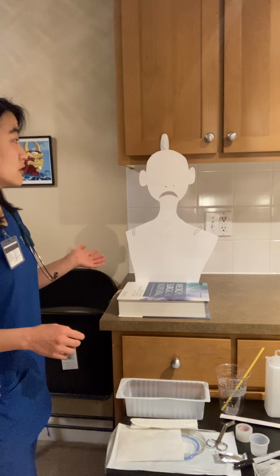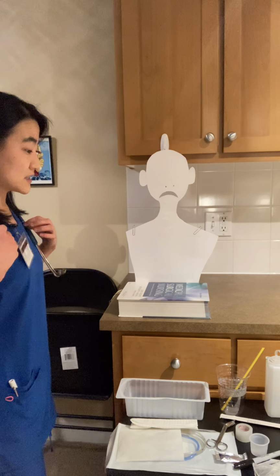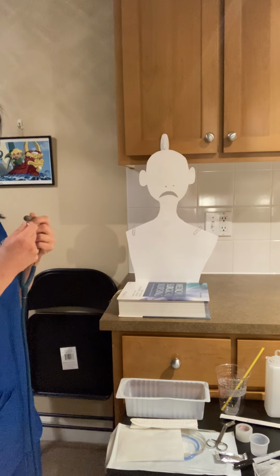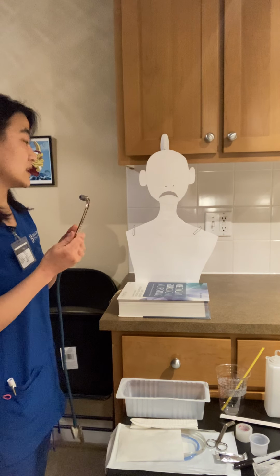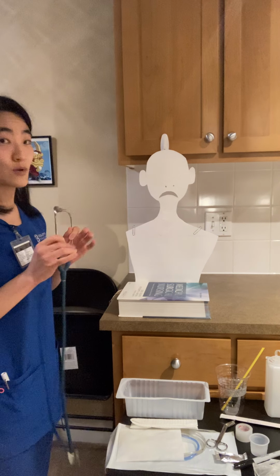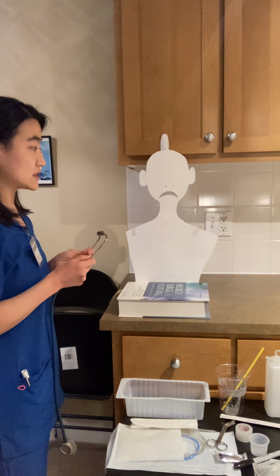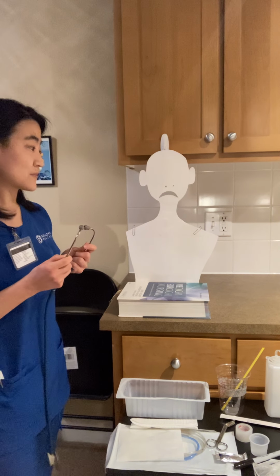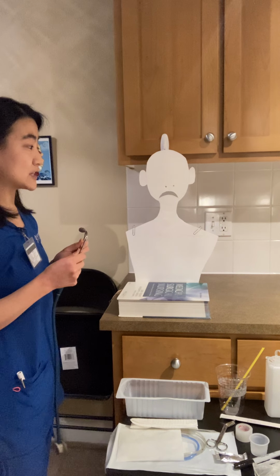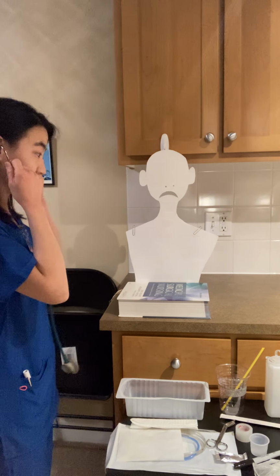So if the patient isn't already, I'm going to place him in high Fowler's before we get started, and then I'm going to make a couple assessments starting with lung sounds. The reason I'm auscultating his lungs before the procedure is to get a baseline of what his lungs sound like, so that when I auscultate his lungs after the procedure, I can listen for changes that might indicate that the nasogastric tube has been placed in the lungs where it shouldn't be.